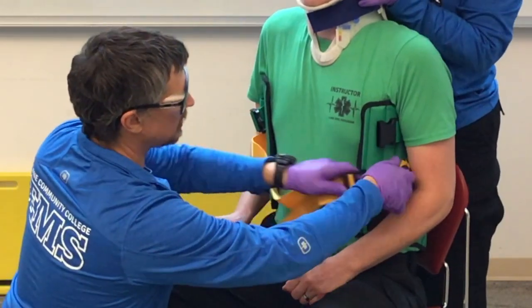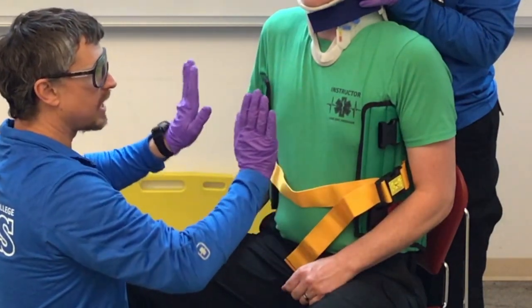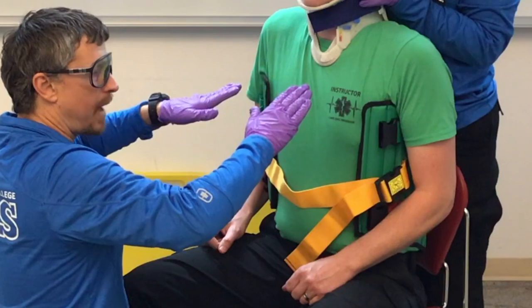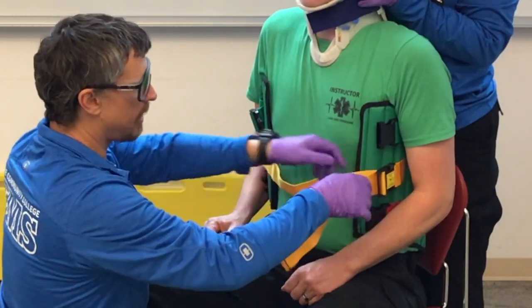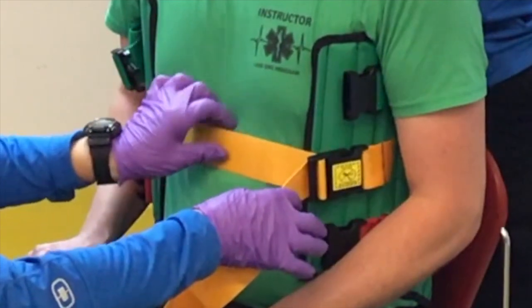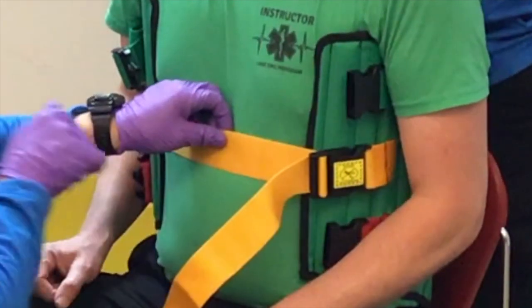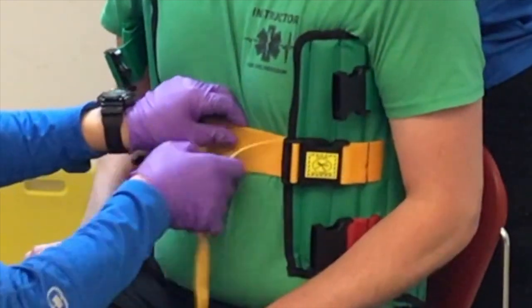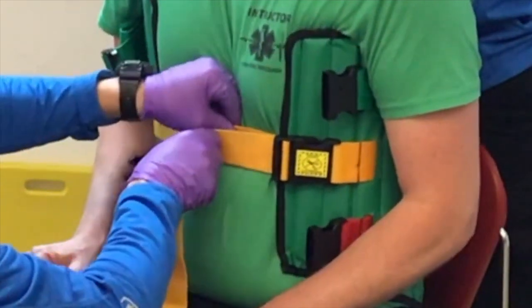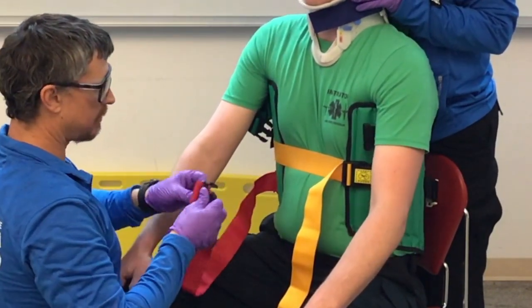We do the middle strap first because it positions the KED properly. If we do the top strap first, it's going to pivot it back. When I get close to tight, I take one hand in the middle, push in with one hand, and pull with the other — that way I don't rotate my patient. Then I do the bottom strap the same way: push and pull.